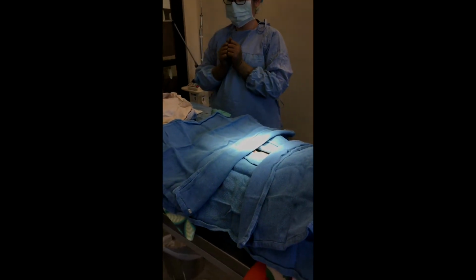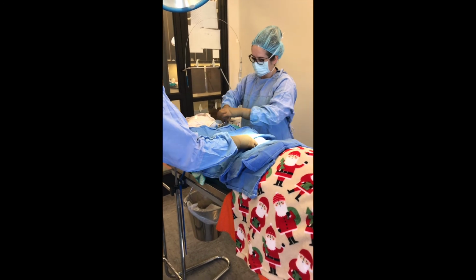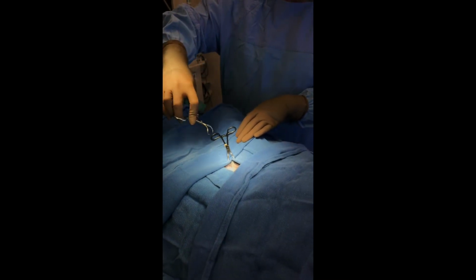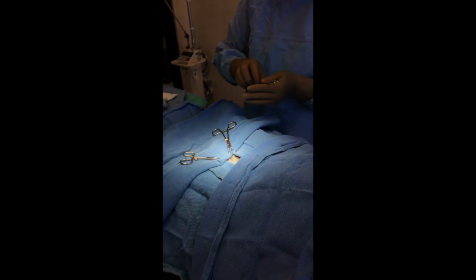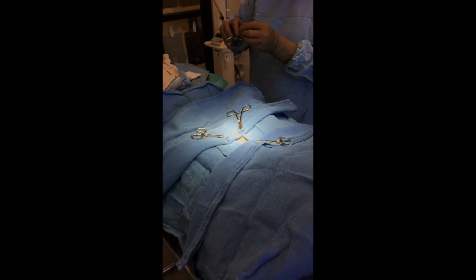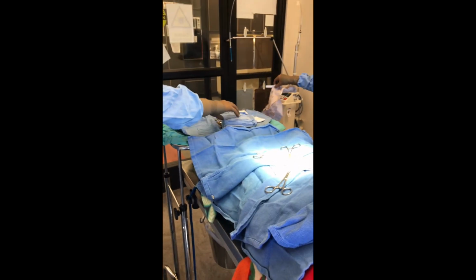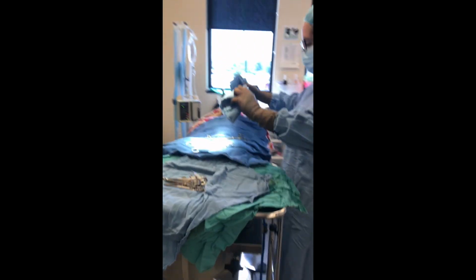Before I clamp these, do you want to see if that's an okay feel? That looks good. You're open.